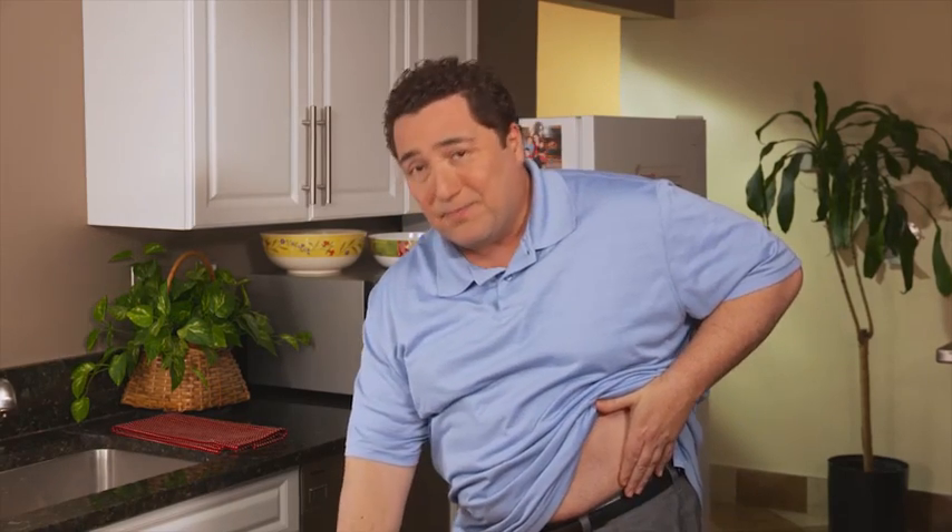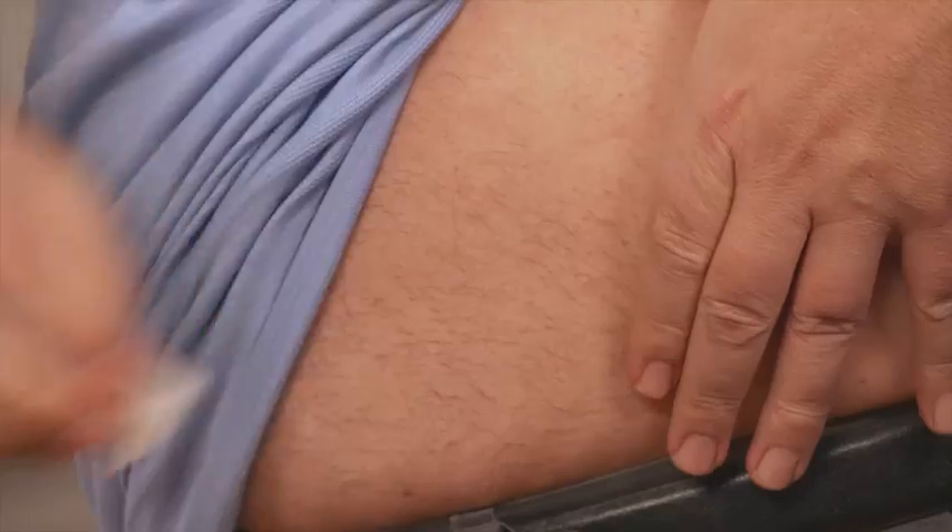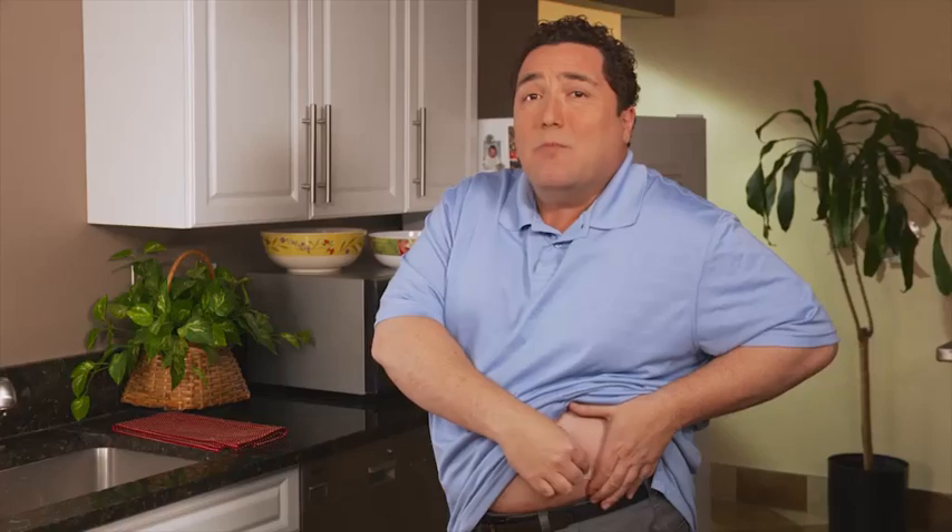Whether you're injecting in the abdomen or thigh, as part of healthy injection practices it's important to rotate your injection sites. Move the injection down by a finger's width with each injection, then change to a new site each week. With the second alcohol swab, clean the small area of skin where you plan to inject. Start in the middle of the site and, moving in a circular motion, clean the whole area. To reduce any stinging, be sure to let the alcohol on your skin air dry completely before you inject.